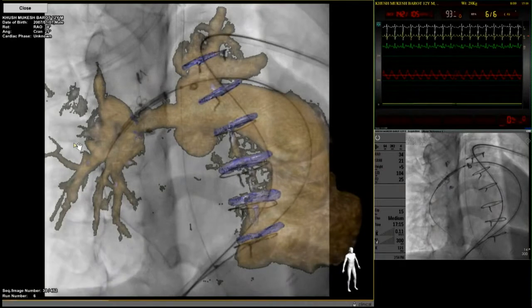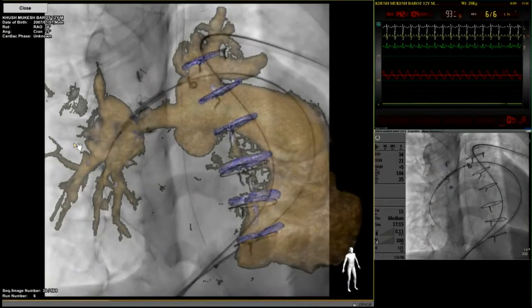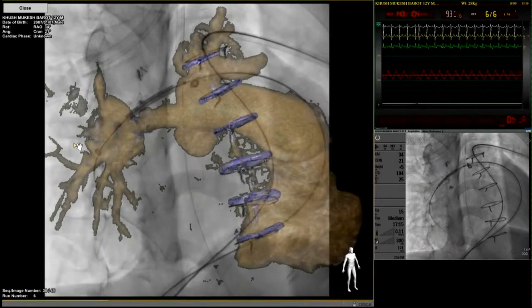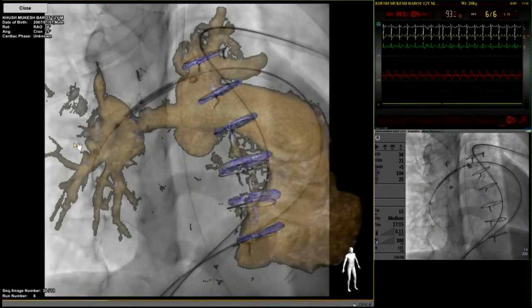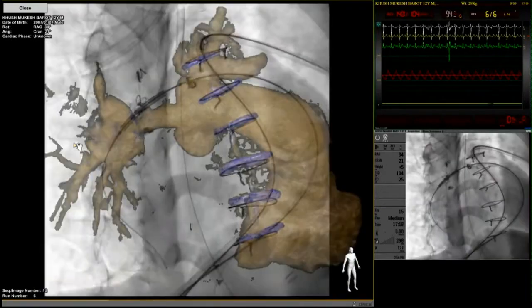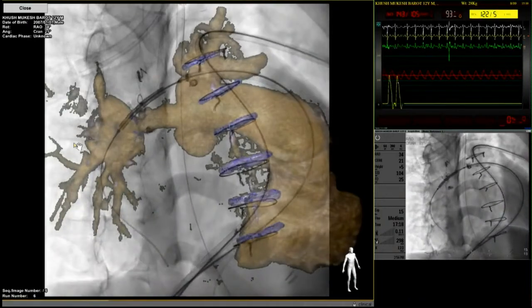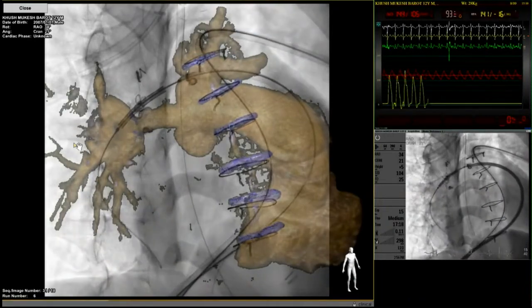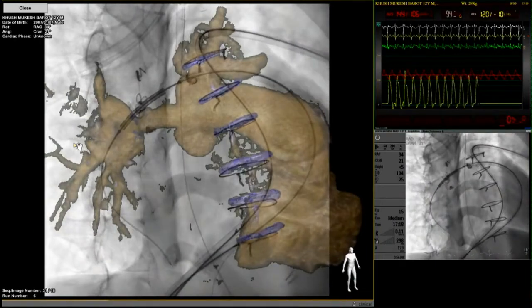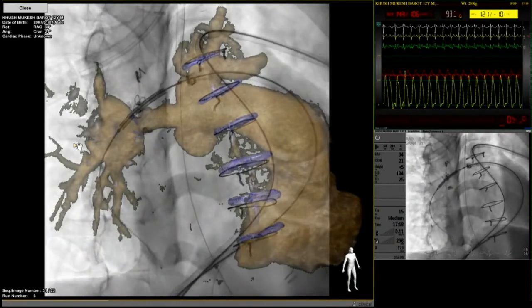Your concern was, is it that simultaneously we have to do, otherwise there will be a hyperperfusion pulmonary injury on one of the sites? One of them, yes. Okay. Yeah, it's probably not as critical and as flow limiting as we might think. Okay, now let me again check. It's quite all right. I just raised the point because that would be one of the ways to approach it, so I thought it is worth raising that point.